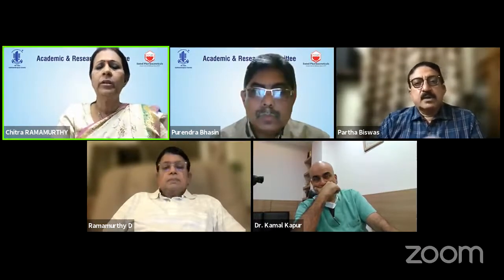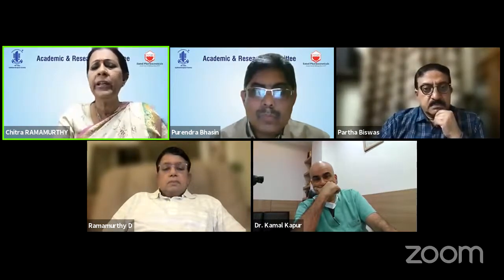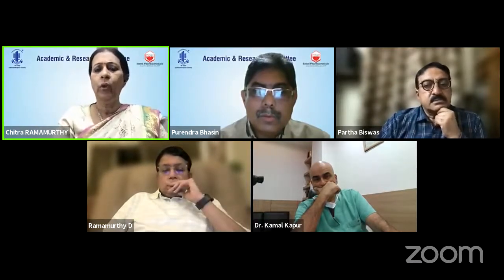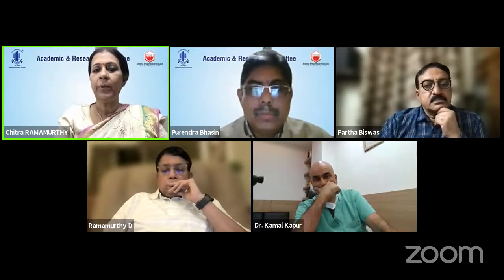Why would you? You are not anyway looking at a presbyopic IOL. So how does it matter if it's LASIK or a phakic IOL? Why would you not prefer a LASIK for a +3 diopter?